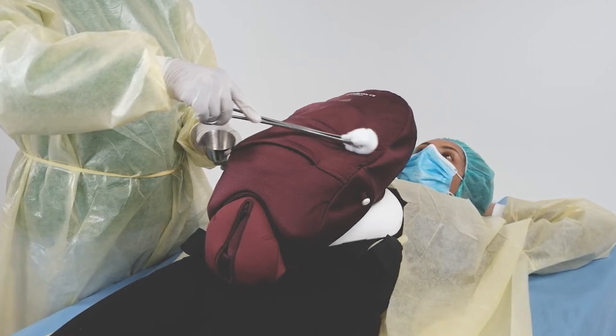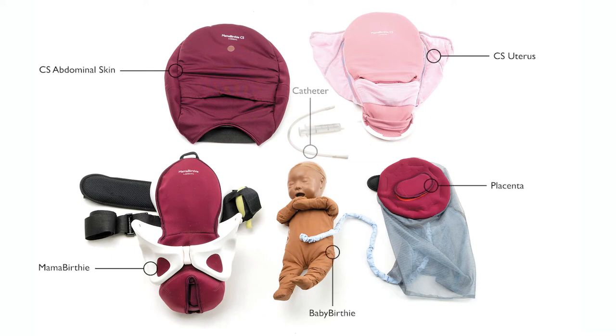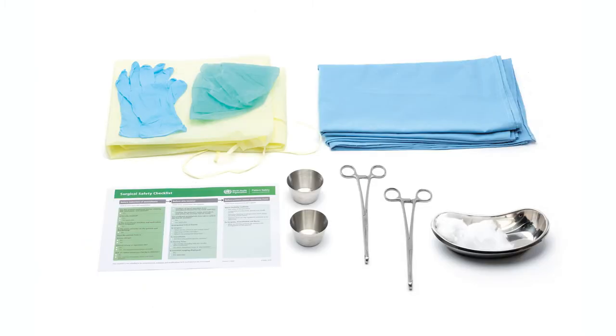For this simulation, you'll need Mama Berthi with the CS module, including uterus and abdomen skin. Baby Berthi with placenta and a catheter. In addition, you'll need surgical instruments and personal protective equipment that are not included.